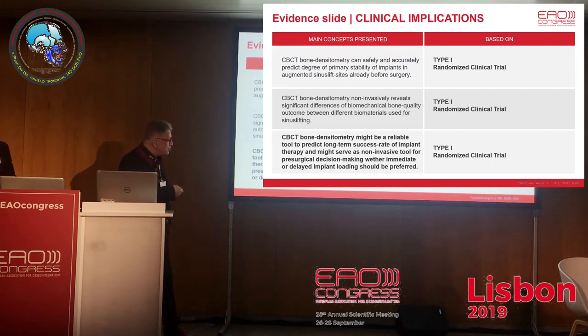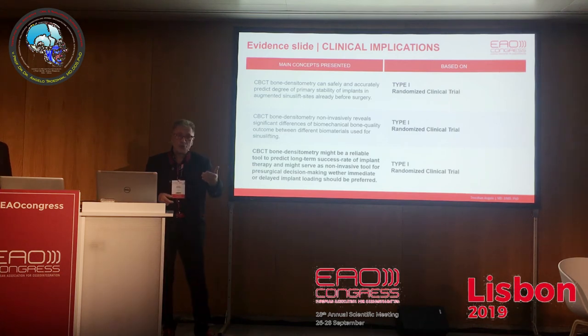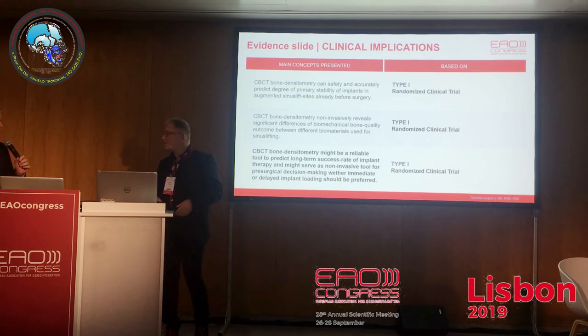And for the general practitioner and for the implantologist in his own office, CBCT bone densitometry might be a reliable tool to predict long-term success rate of implant therapy and might serve as a non-invasive tool for pre-surgical decision making whether immediate or delayed implant loading should be preferred. And I just can remind you of this brilliant lecture this morning with Professor Kamaresh, who demonstrated to you what it means to do immediate loading in the upper jaw, in the maxillary bone, with a higher loss rate than when it's compared to the.